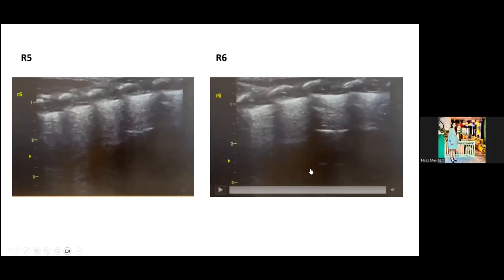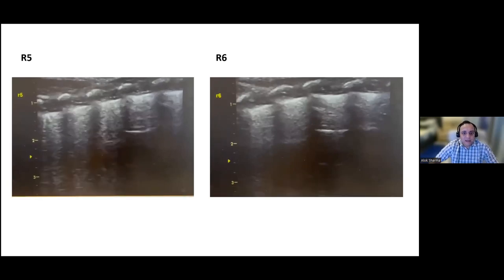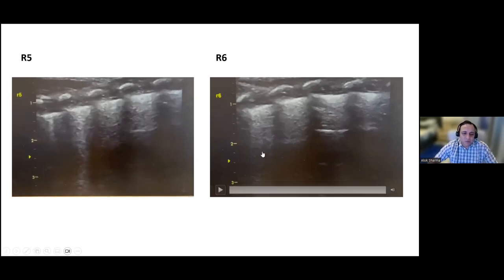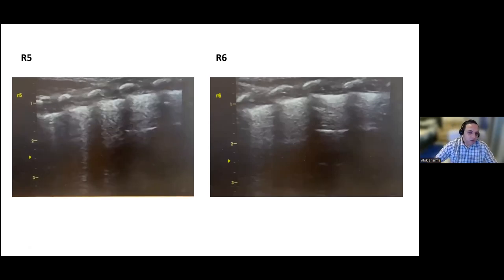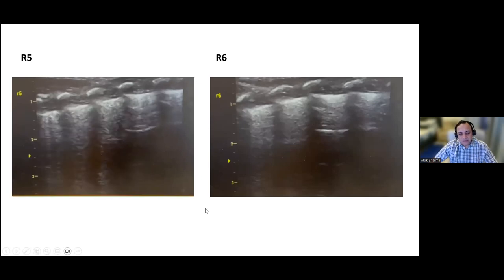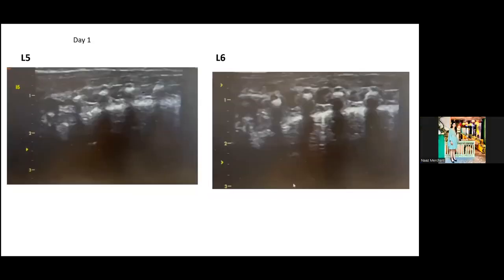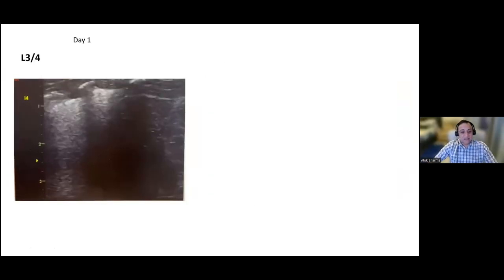This is classically a situation where I'd follow the clinical course. I'd be hinging on TTN at this particular point as my possible diagnosis, having looked at all the images. From our perspective, you could do serial ultrasounds and see how that happens. But my gut feeling is... We did do serial ultrasounds. I'll take you through the progress. Okay, beautiful. Well done.